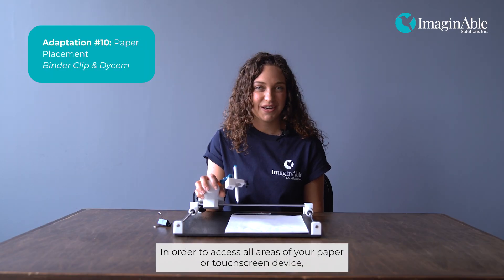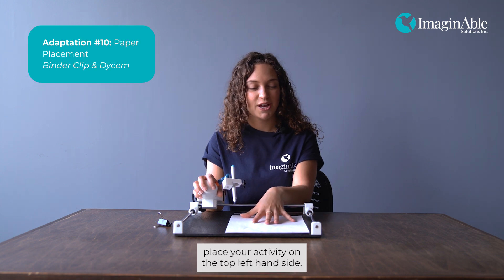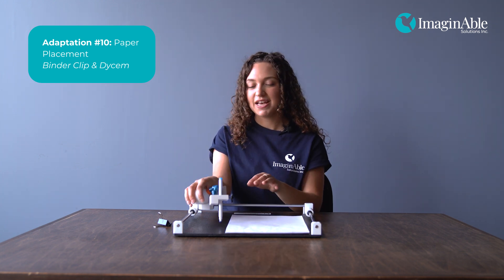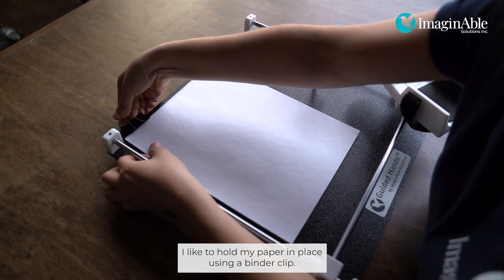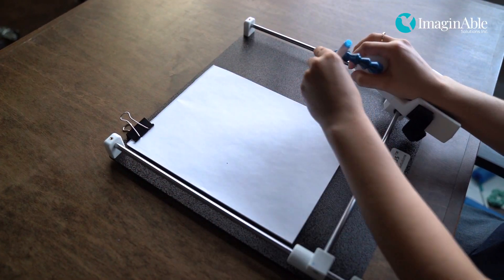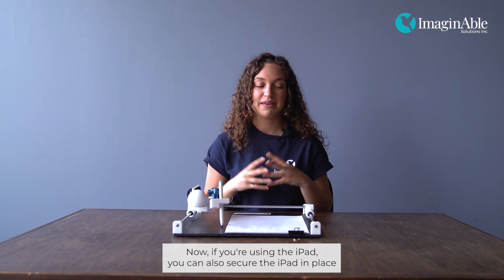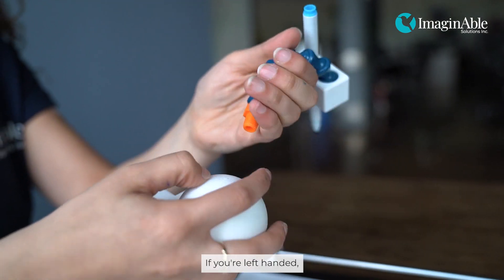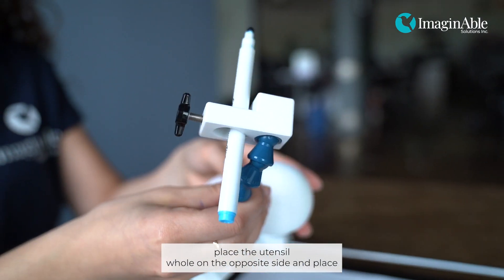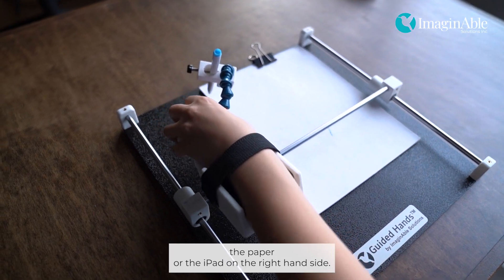In order to access all areas of your paper or touch screen device, if you're right-handed, place your activity on the top left-hand side. If it's a single sheet of paper, hold it in place using a binder clip. If you're using the iPad, you can also secure it in place using a non-slip sheet such as Dycem. If you're left-handed, place the utensil on the opposite side and place the paper or the iPad on the right-hand side.